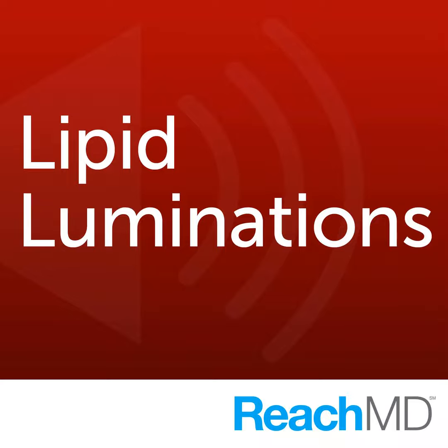And I also want to point out that patients that have cardiac events with low or even zero calcium score are clearly outliers, that doesn't happen very often. But if you look at that group from the MESA cohort of patients, most of those patients had high or relatively high carotid IMT. And so the message I don't want the audience to get is that everyone should get both tests, but clearly they are complementary in their risk assessment. And so as in most tests, what your institution does best is probably what you should do at your institution.